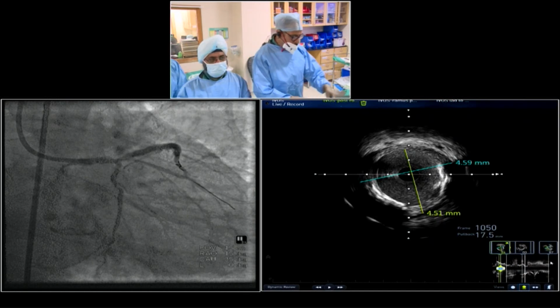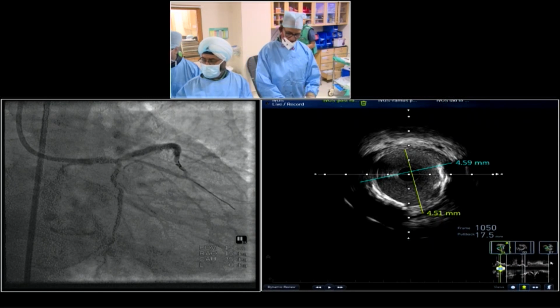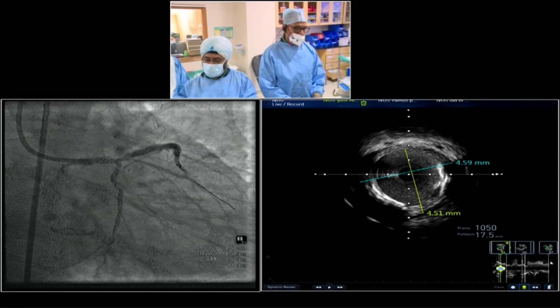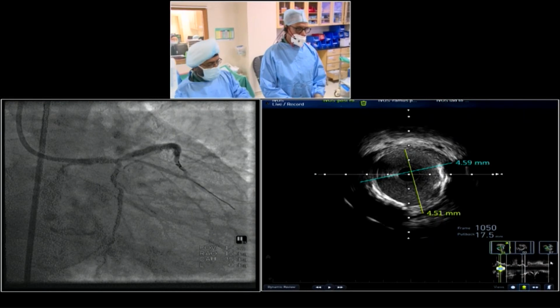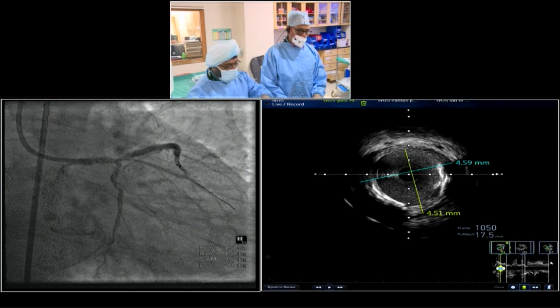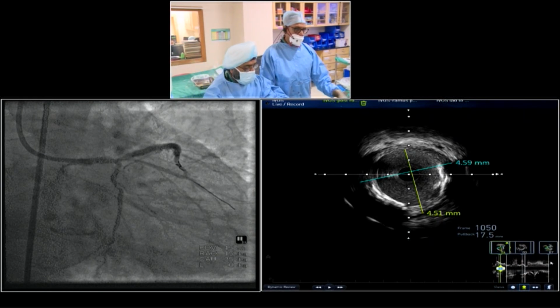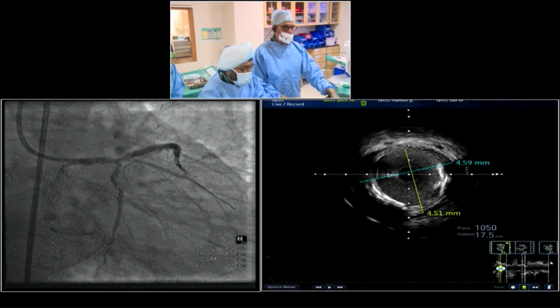I'll leave it to Dr. Shri Kumar for questions, answers and your valuable comments on this summary which I have told you so far. Thank you, Doctor. You have made the mid-LAD look better. Now I think you are trying to cover the ostial LAD and distal left main with a crossover stent. LCx ostium looks free from disease. Hopefully we shouldn't have any trouble there, but you are still protecting the LCx with the wire, and the bed preparation is already done. Left main distal portion and ostial LAD are dilated with a balloon.